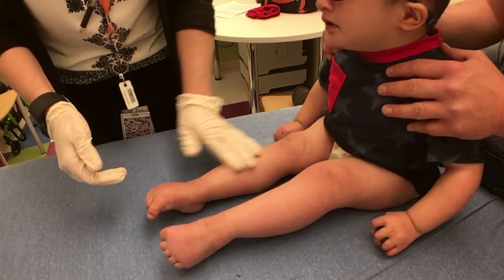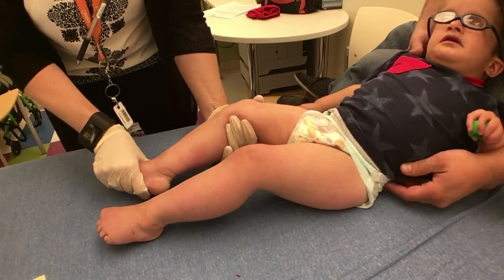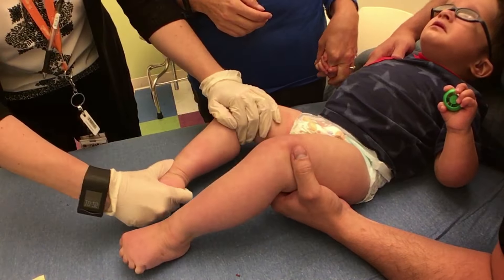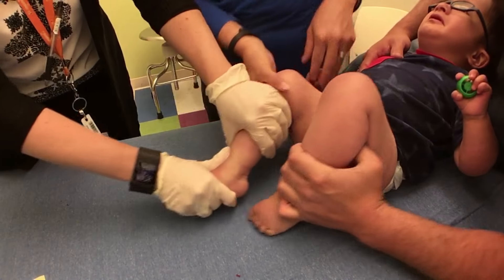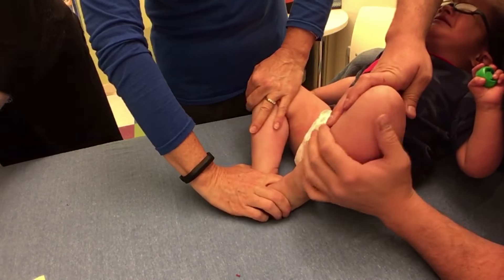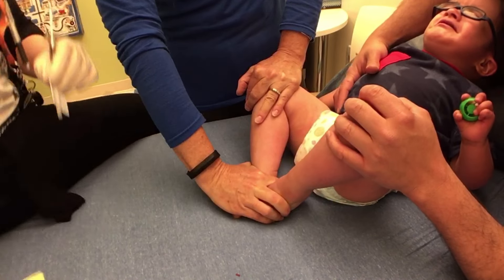Hey, can you lay down buddy? Ready? Alright, sit back for dad — lay down, good job. Lay down, good job, just lay still. Squeeze my hand, there we go. You can hold him in kind of a butterfly position — that'll give me access to both spots.